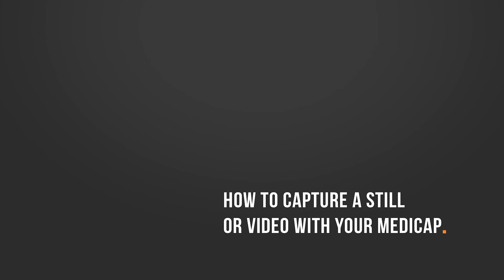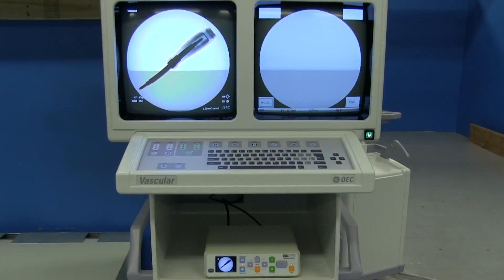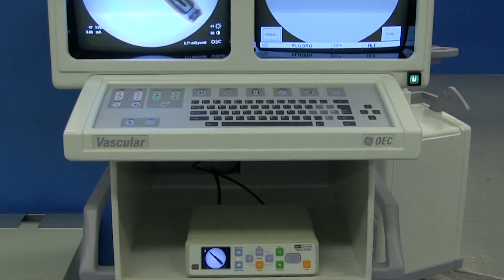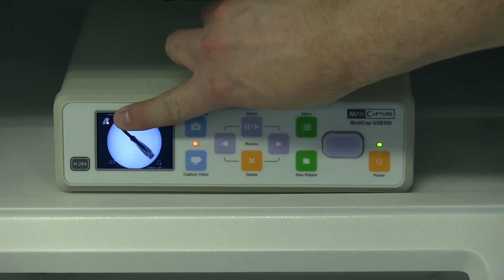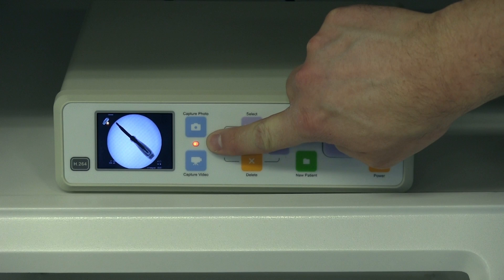When you're ready to capture a still image or a video with your MediCap, simply take your exposure as you normally would. You'll notice that a preview image will pop up on the small LCD monitor on the front of the MediCap. There are a couple of indicators that will remind you that you need to have the USB drive plugged into the front of the MediCap. One is on the LCD screen itself — a small icon shaped like a USB drive with a red X next to it. The other indicator is an orange LED light between the capture video and capture photo buttons.